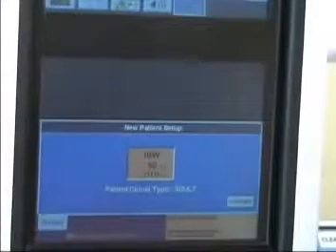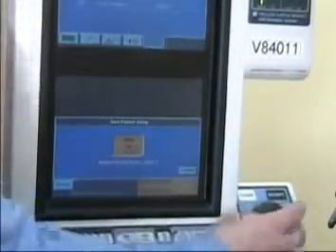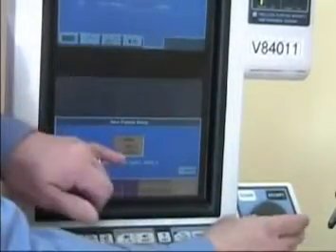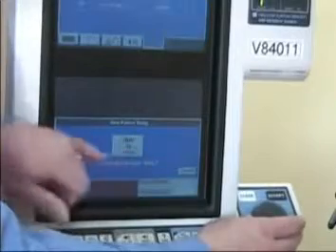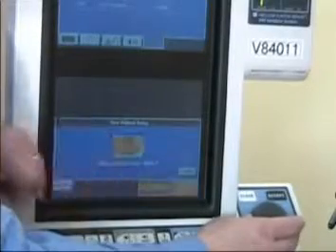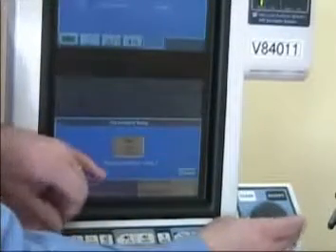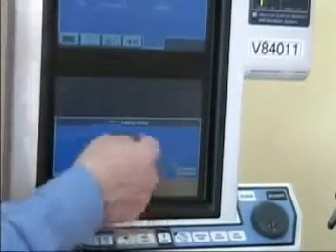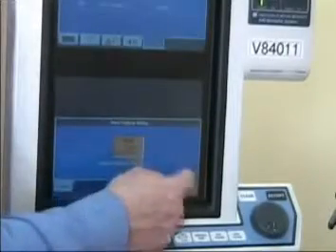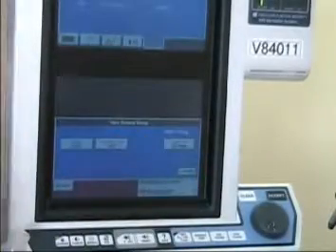And we go to the rotation knob. We turn the knob until it says 150, or the ideal body weight in kilograms is 70 kilos. We have the body weight that we want. We press continue.